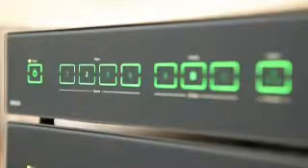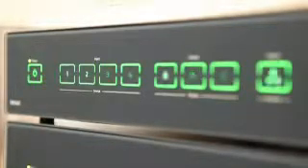The overall system is a closed unit that's supplemented and rounded off in line with the needs of an endoscopic operating theatre and through integrated components for teleconsultation and documentation.